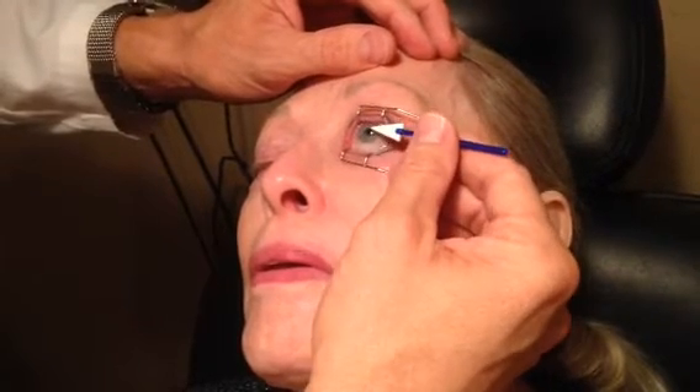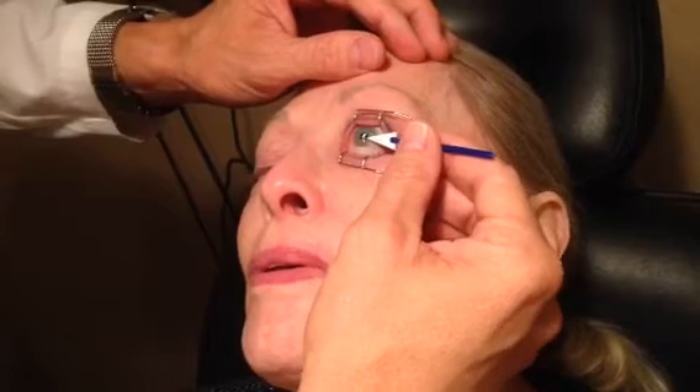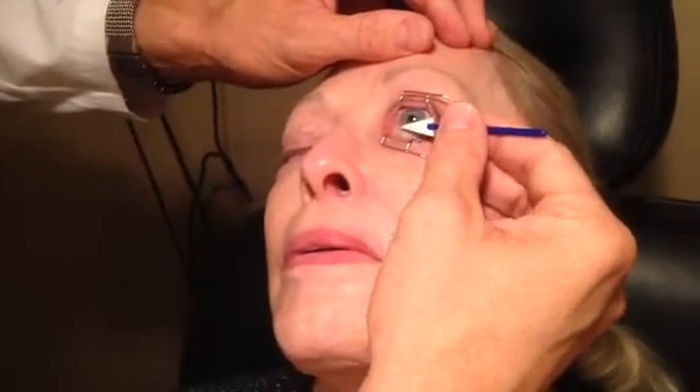Beautiful job. I'm going to dry around with it a little bit more. Super. Right there is where we want it to heal up. Moving right along. You're doing great.